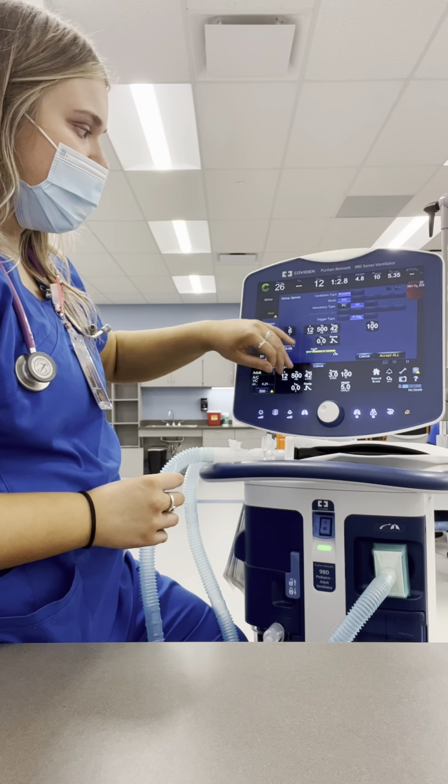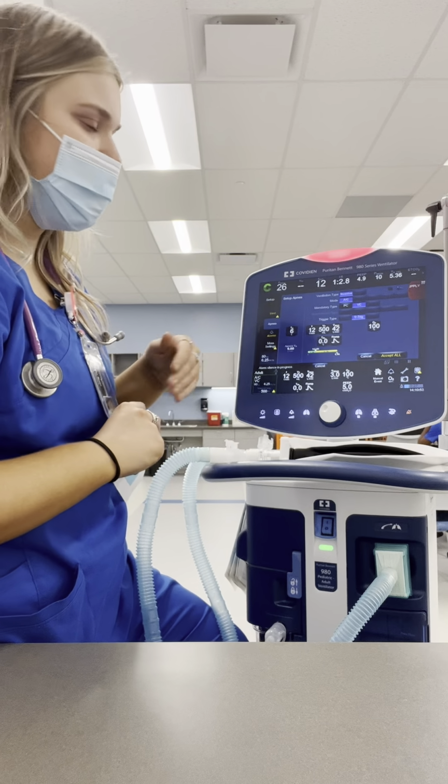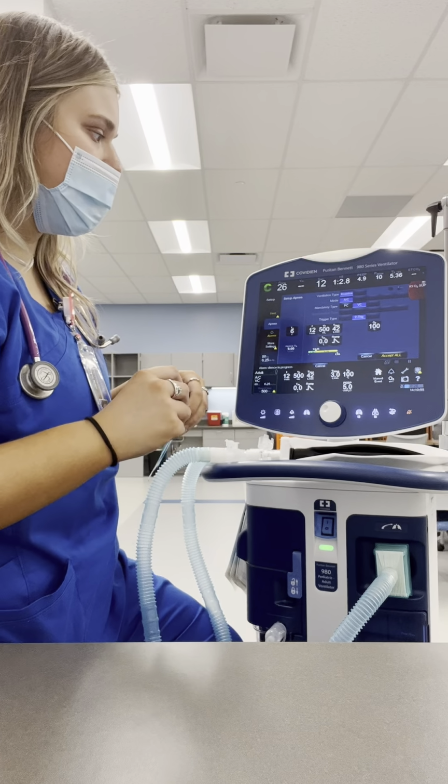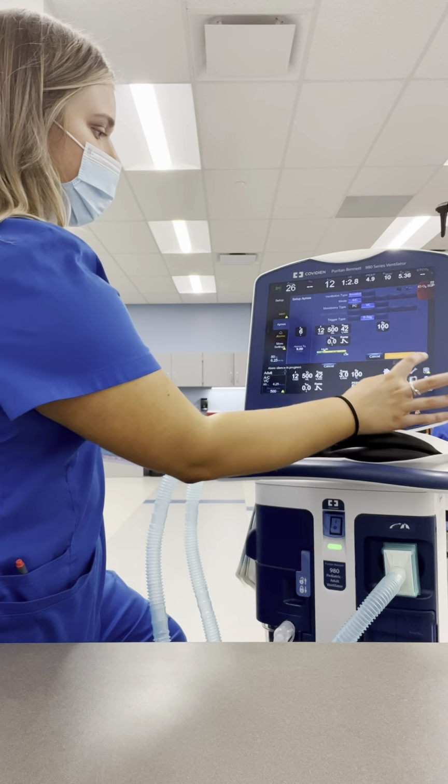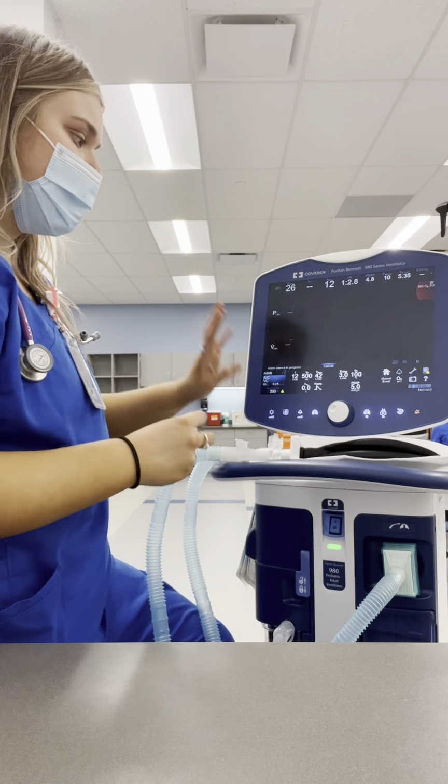And then the frequency, tidal volume and flow are all the same. It's 12 breaths per minute, the 500 milliliter tidal volume, and 42 liters per minute for the flow. And our FiO2 is, of course, 100% on an apnea setting, which our patient is already receiving. And we're going to accept those. And that is it for setting up the patient on the ventilator.